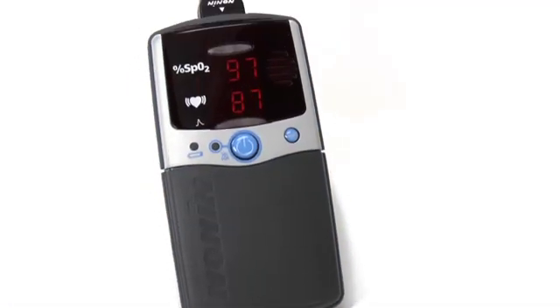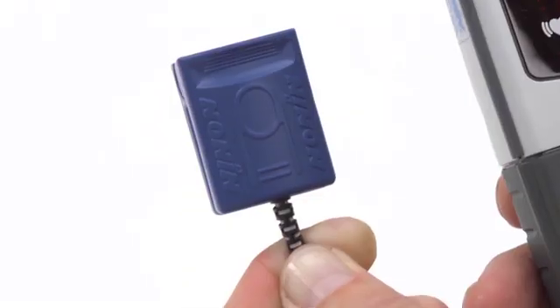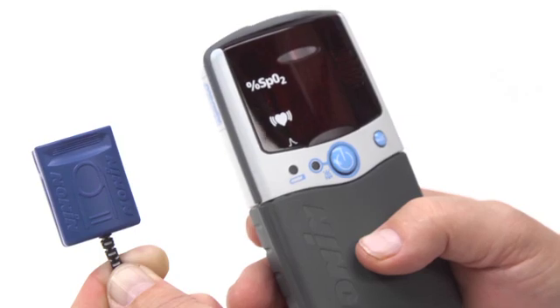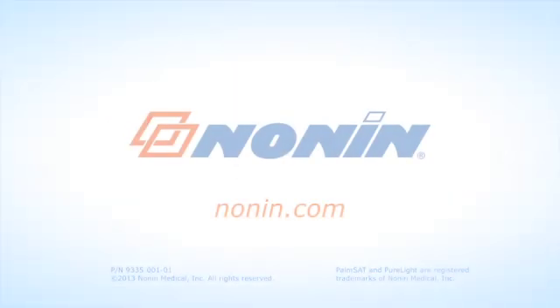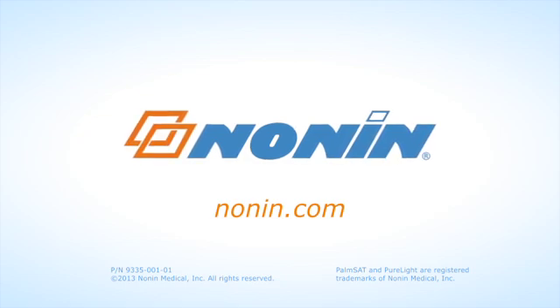With proper use, the Nonin PalmSat Model 2500 or 2500A pulse oximeter will provide consistent, accurate oxygen and pulse rate measurement. You can find additional use information on this and other Nonin products at www.nonin.com.